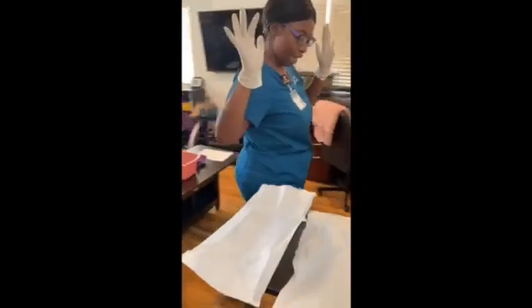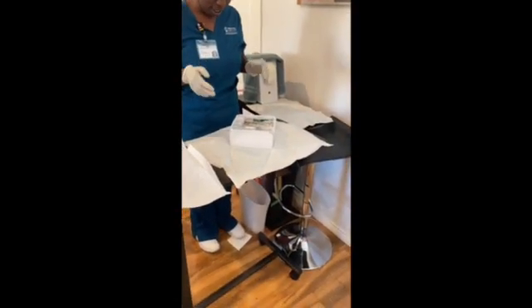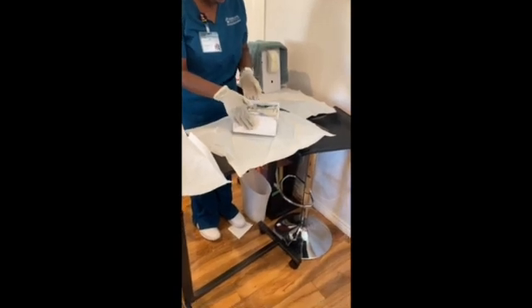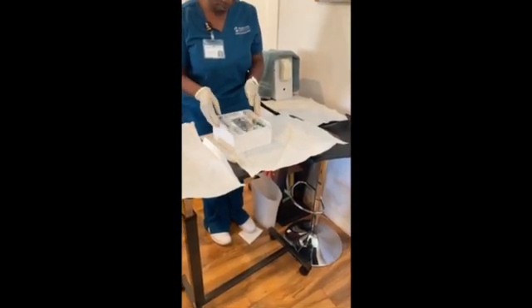Okay, so now that I am sterile, I'm going to go ahead and adjust the kit on the tray, being careful, keeping my hands above waist level.